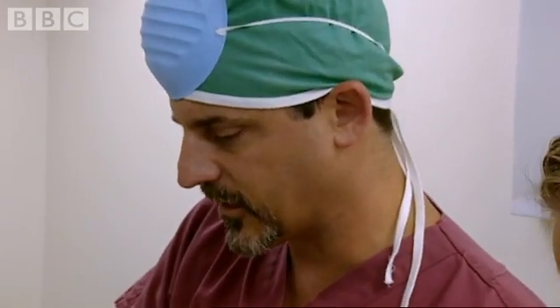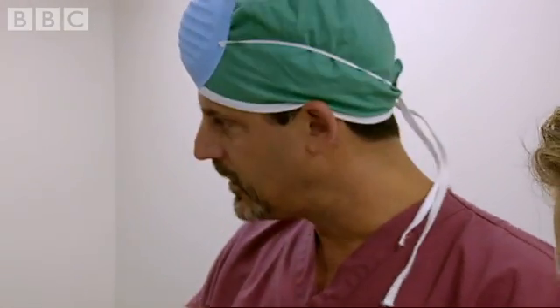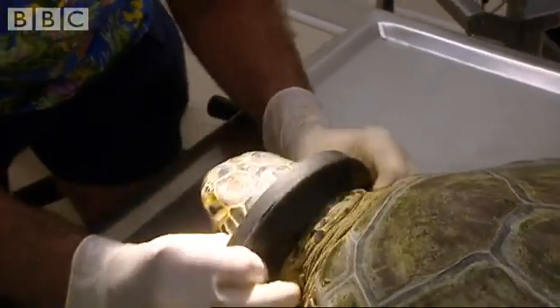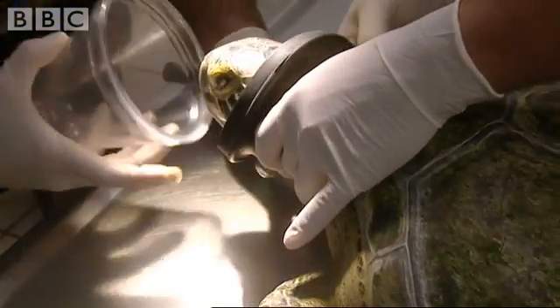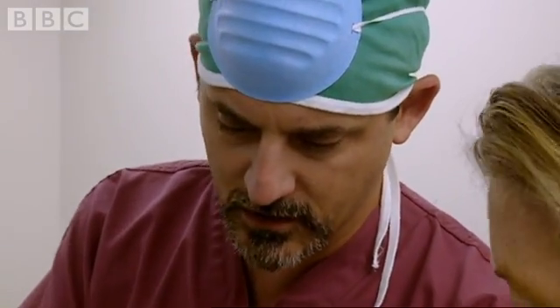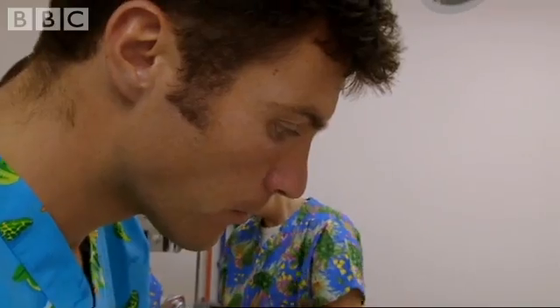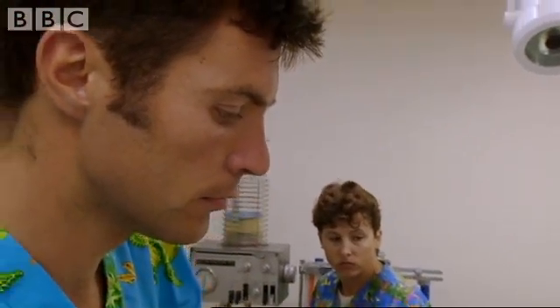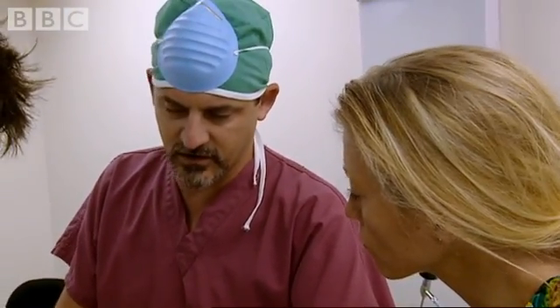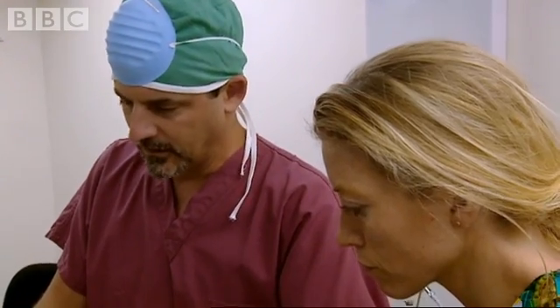Doug Mader is a local veterinarian who specialises in the removal of tumours by laser. Like the rest of the team, he donates his time and expertise for free. She has that one questionable spot, probably in her lungs. We'll go in with the endoscope. If she's negative, which is what we're hoping, we'll sew that up — it's a small incision and very little discomfort or pain — and we'll take the laser and remove the external tumours.